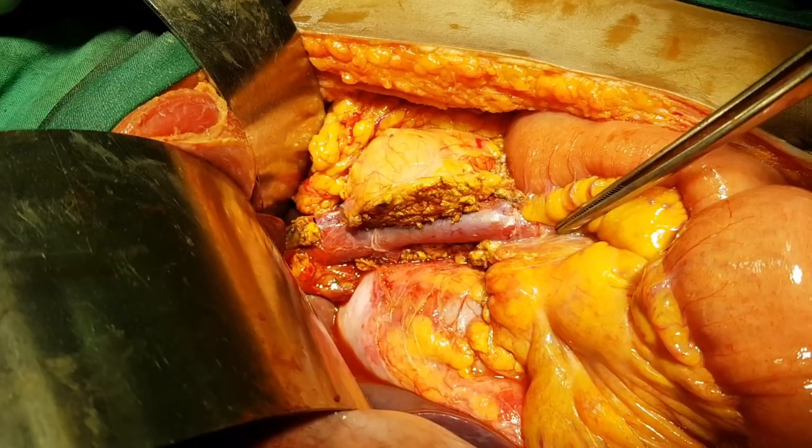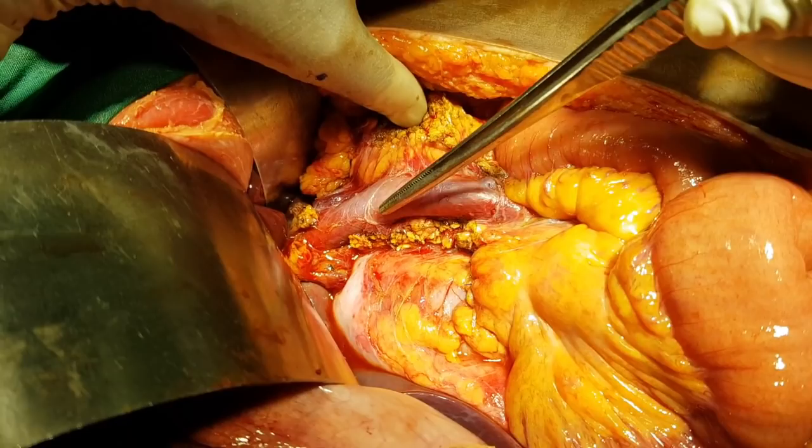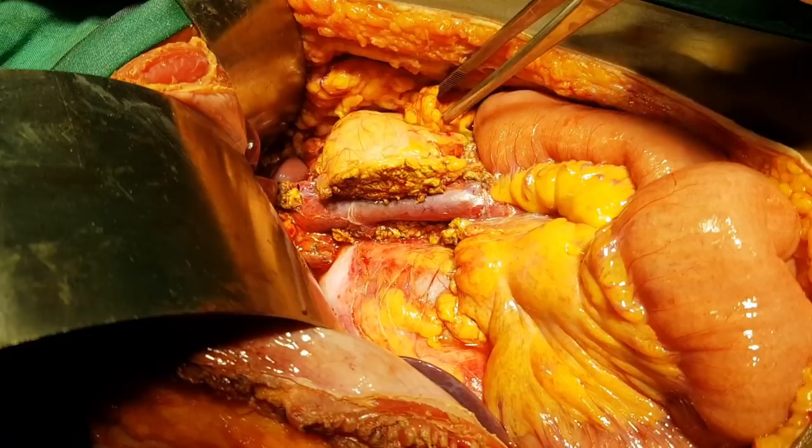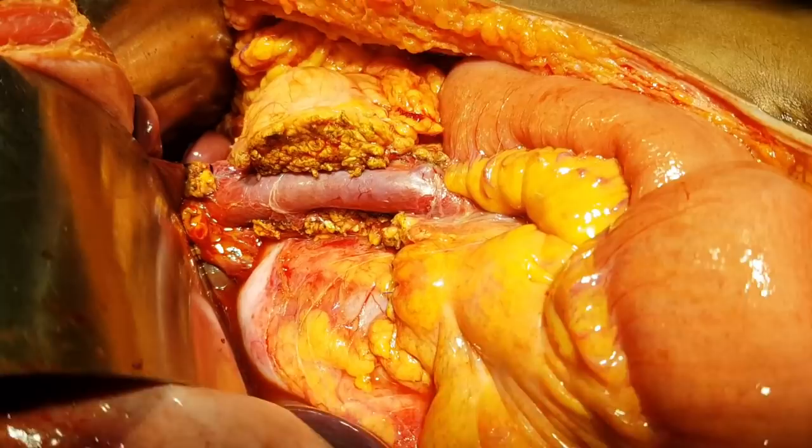You can see the distal pancreas, which is the remnant pancreas. Such clear anatomy has been dissected by Dr. Ramesh, surgical gastroenterologist, Vellore Medical College. You can even see the hepatic artery dissected very well in this case. All the nodes are being cleared, and they are going to do reconstruction.